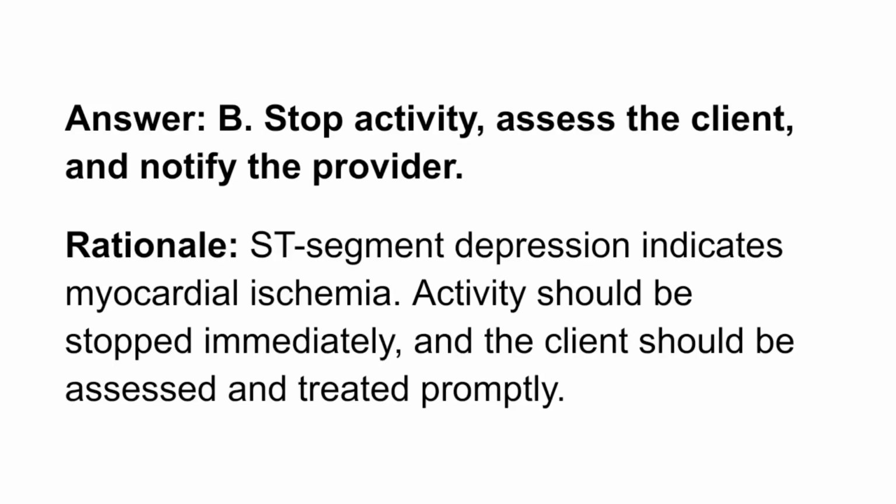Rationale: ST segment depression indicates myocardial ischemia. Activity should be stopped immediately, and the client should be assessed and treated promptly.